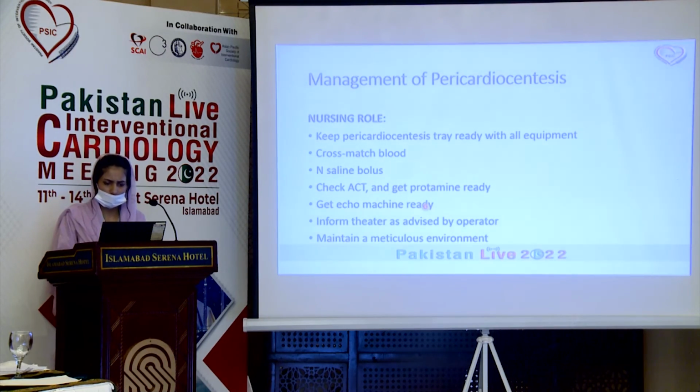infection, cross-match blood, normal saline bolus, check ACT and get protamine ready, get the echo machine ready, and inform the theatre as advised by the operator.